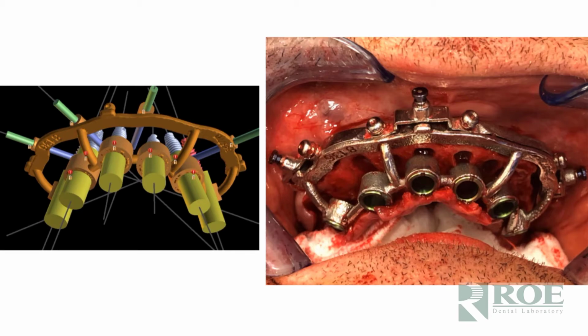And the next step is to drill the osteotomies and place the implants. This is a BioHorizons surgical guide, and on BioHorizons we use OEM sleeves. They have some very nice machining on their tools, and doctors really prefer to have their sleeves placed. So it costs a little bit more, another $20 per sleeve, but they are placed, and the doctor will simply follow the guidelines of the toolkit, and drill the osteotomies and then place the implants.